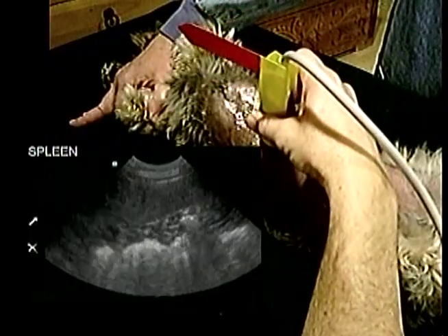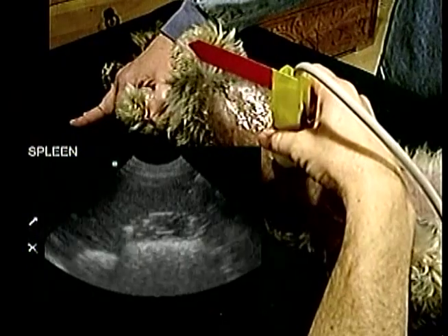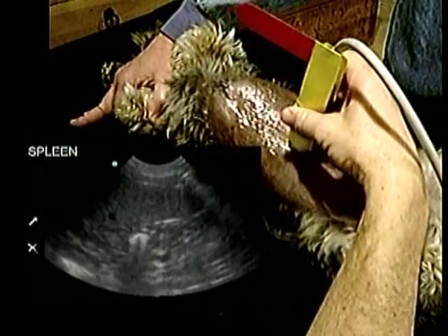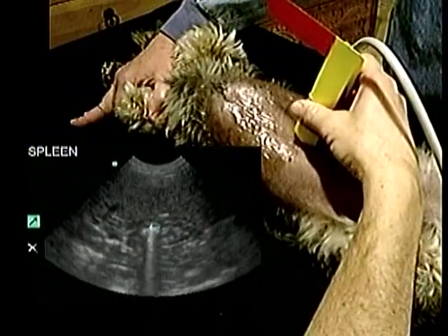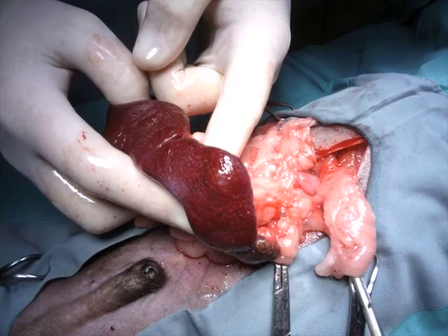One day the patient was running and suddenly cried out in pain, followed by abdominal splinting. These are common signs of a dog showing acute stretching or rupture of the splenic capsule due to hemorrhage into or outside of the spleen. Splenectomy was performed and the patient recovered. These are images of the splenic mass during surgery. Hemorrhage was within the parenchyma of the spleen.